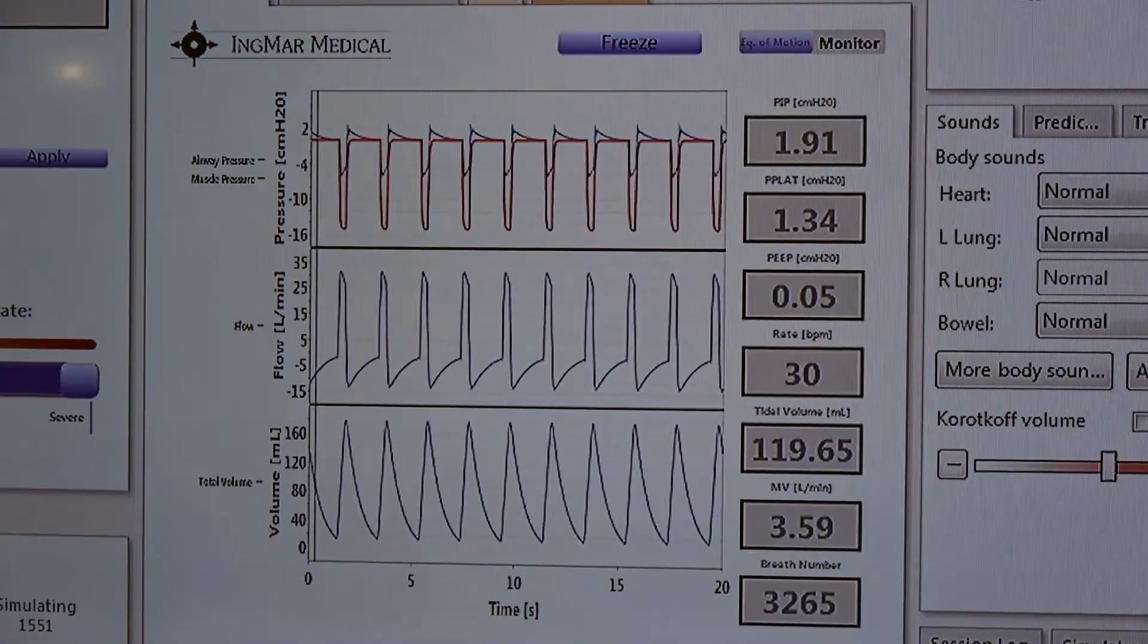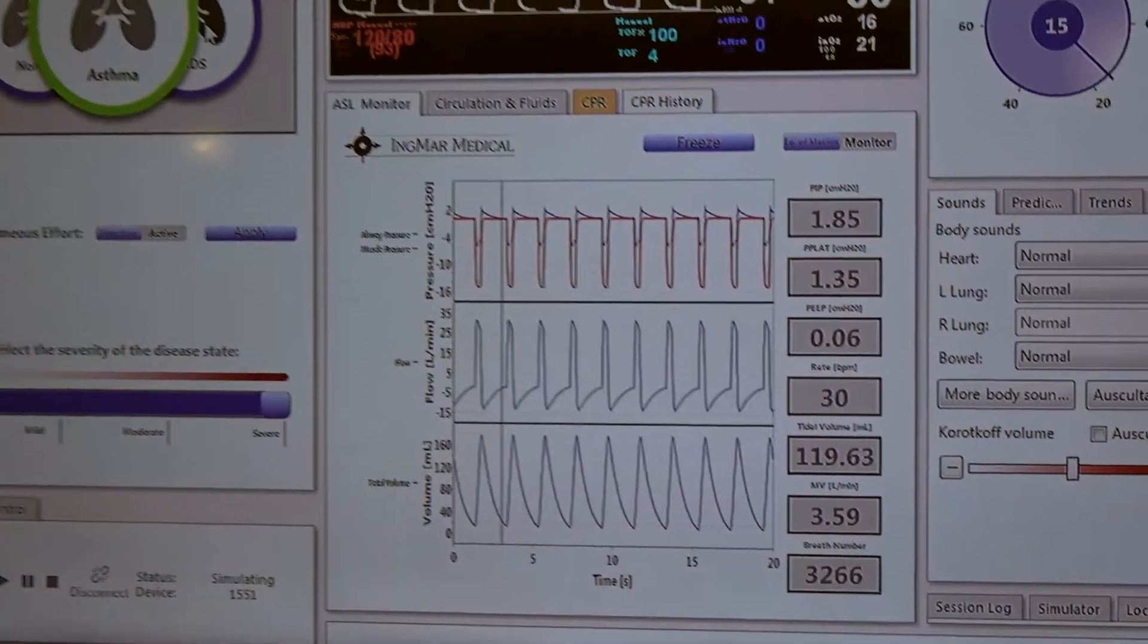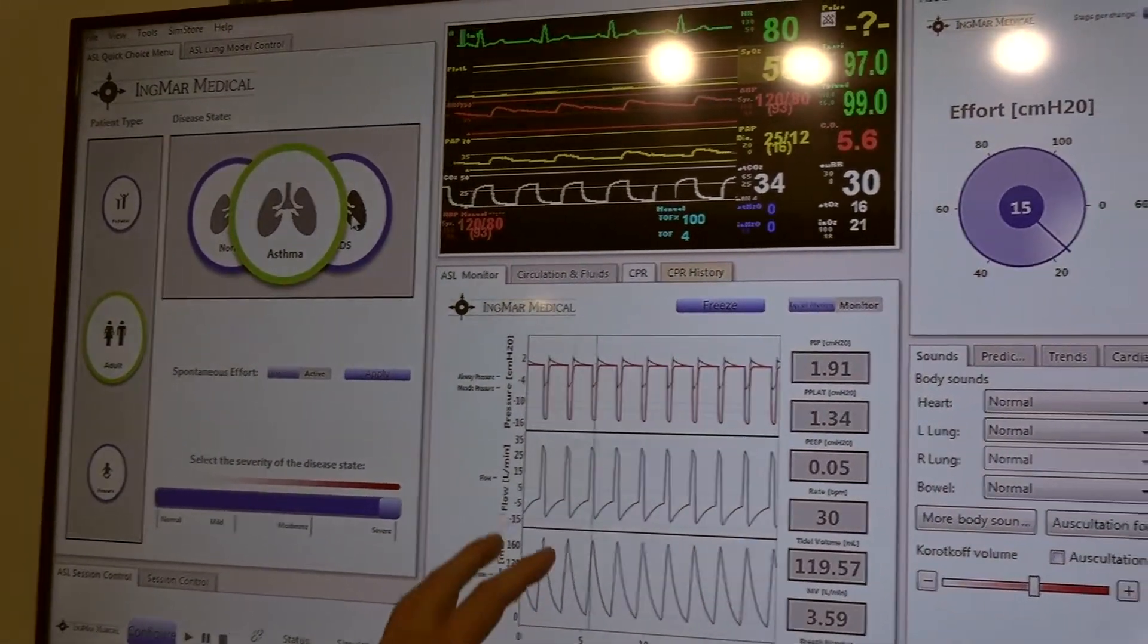This means you can turn your SimMan into a spontaneously breathing simulator and simulate scenarios with a patient that is breathing spontaneously while being ventilated.